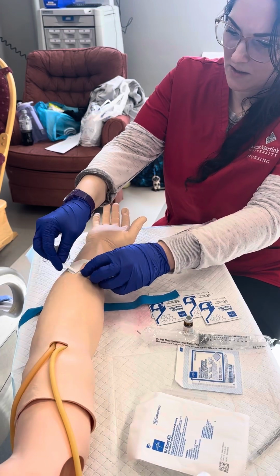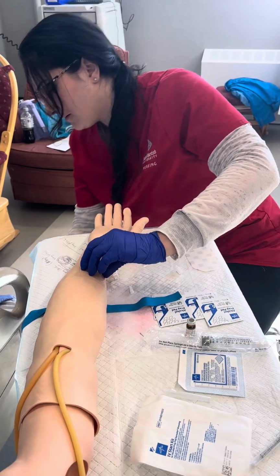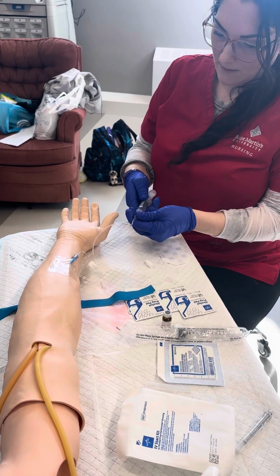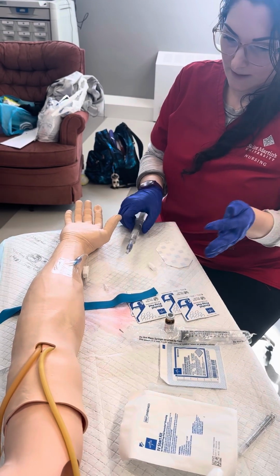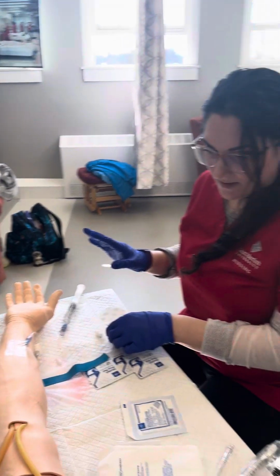Okay, so there should be no pain with that, no pulling or anything like that, but if you have pain, let us know. There's no blood on my gloves, but if there was, I would change them. All right, so I aspirated and, okay, that's good. Now I'm going to prepare my medication. I'm going to do my second check.